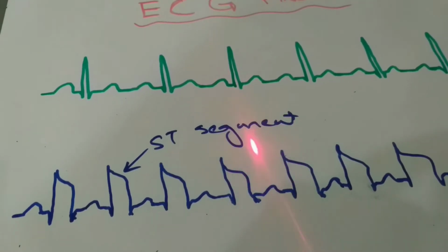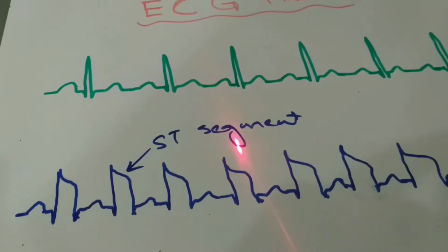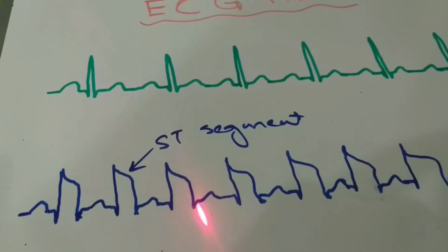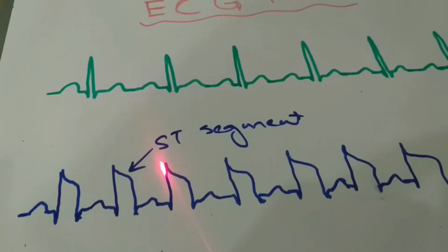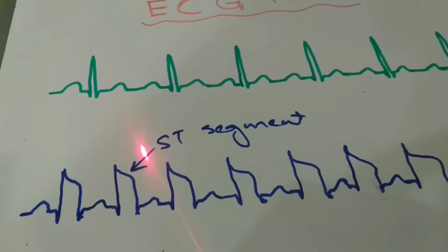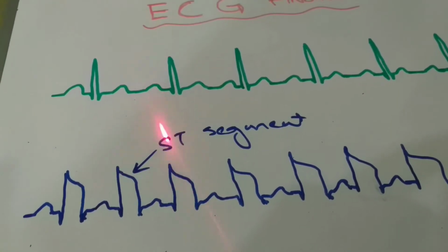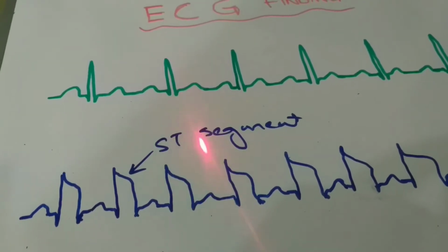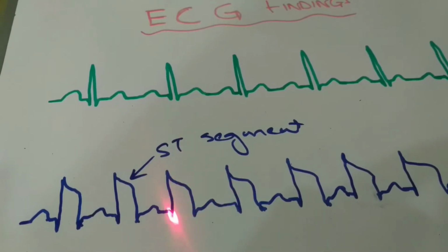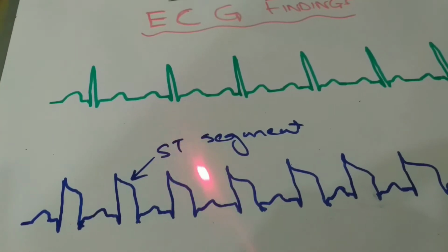In itself, this is a sign that you do not need any cardiac enzyme for its confirmation. And whenever you see in ECG leads, segments or series, that there is an ST elevation, always remember one thing: that particular coronary artery is completely occluded, and the muscle it is supplying, the wall it is supplying, is at risk of dying. There is a need of urgency. You need to be very fast. You need to manage the patient very fast. This is a 911. This is everything which points towards the red signal. This is a critical state.